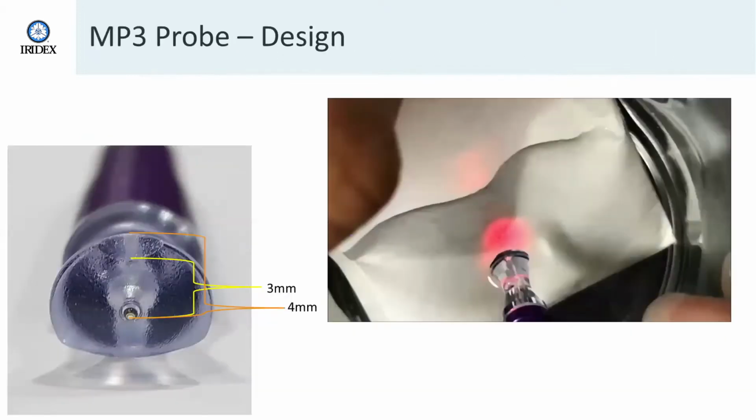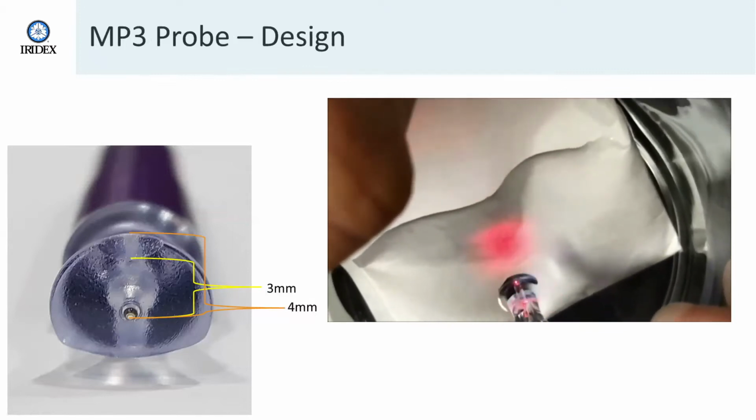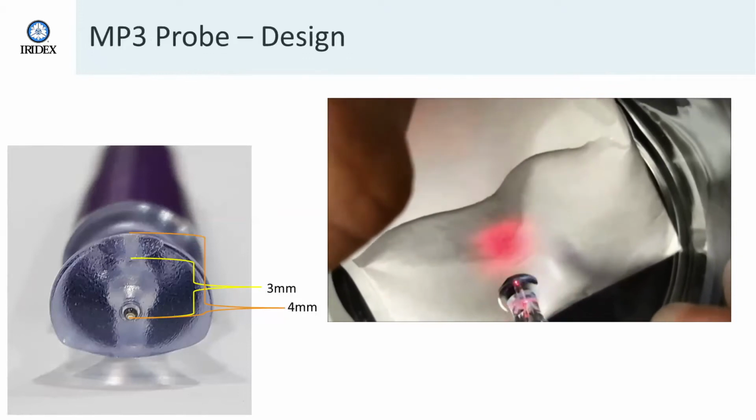This is just a small demonstration to really show the effects of using the liquid interface versus not using the liquid interface. We'll take the MicroPulse probe and we'll place it in a Petri dish that holds balanced salt solution with an envelope underneath as a target, and you can see how the beam profile will change when you're coupled with the tissue with that liquid interface as opposed to not coupled. And as the probe comes out of the liquid interface, you can actually see the scattering of the photons happen. Here we are out, moving into the liquid interface, and then back out. I'll play that one more time for you. Air, coupled with the interface, then moving back out. It's quite dramatic.